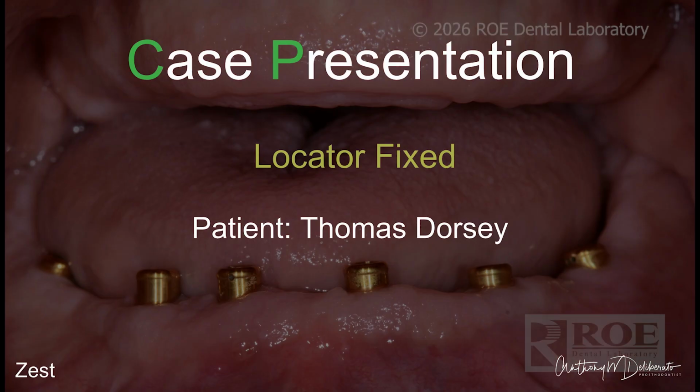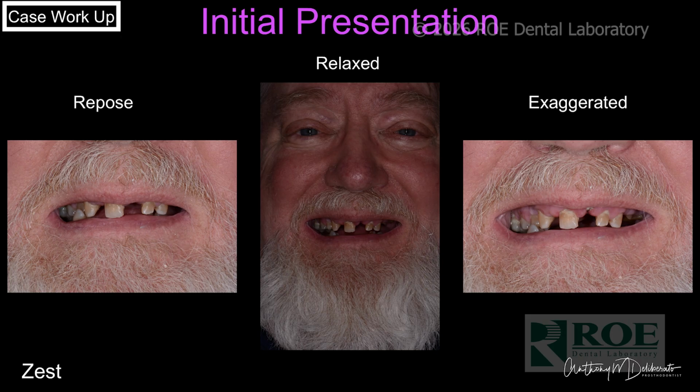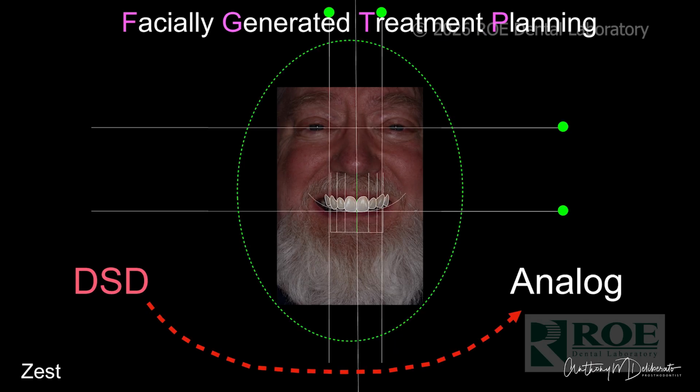Okay, let's go through this last case and then we can call it a weekend. This is my patient, Thomas. Same types of photos. I'll try to go a little quicker. Some of this might be repetitive.